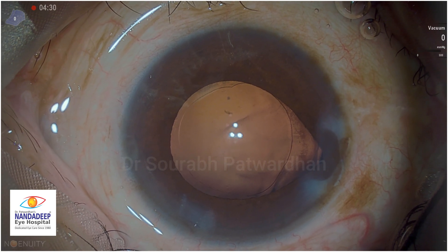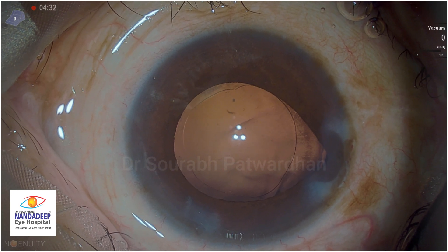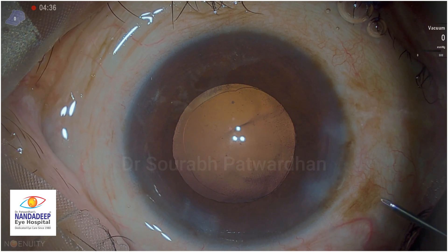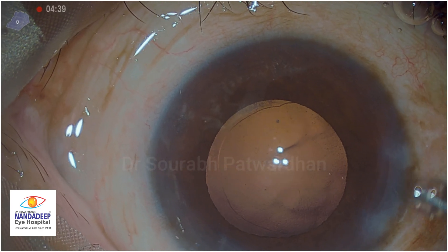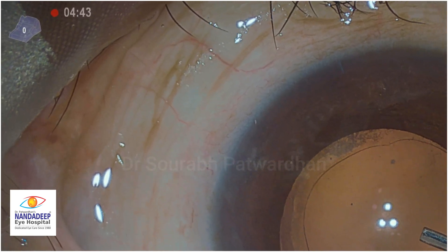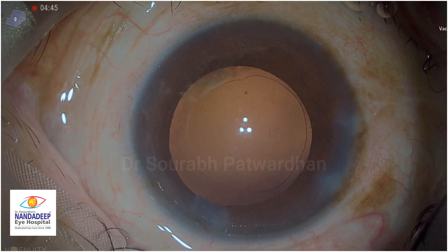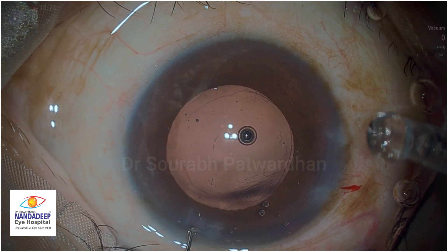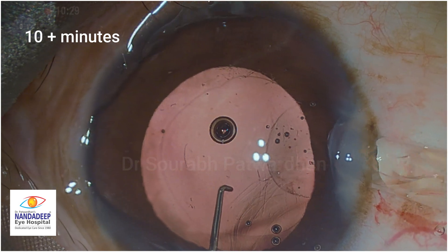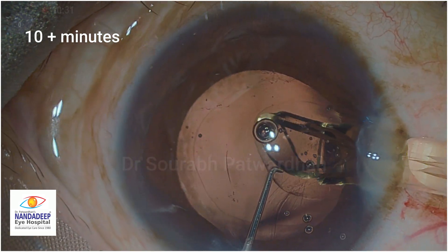One of the things I noticed on Constellation is that because it's a forced infusion system, you tend to have a little more chance of iris prolapse when you take out the probe. So what I generally do is stop the irrigation before I come out. Watch the timing on the video - it's around 5 minutes here, and then when I go for the IOL incision it's almost 10-plus minutes. So what happened in those 5 minutes?